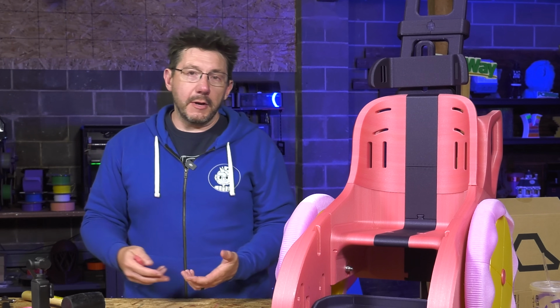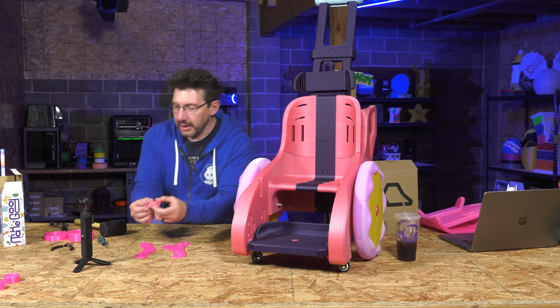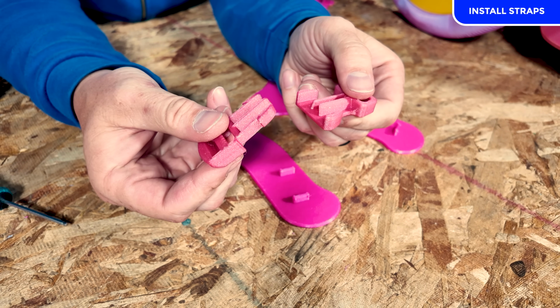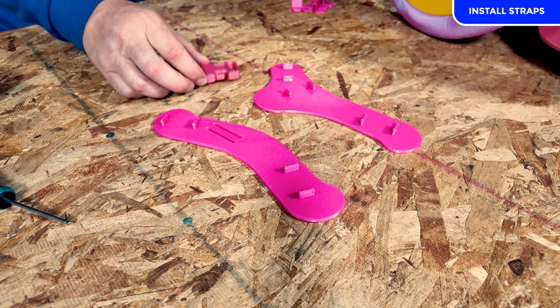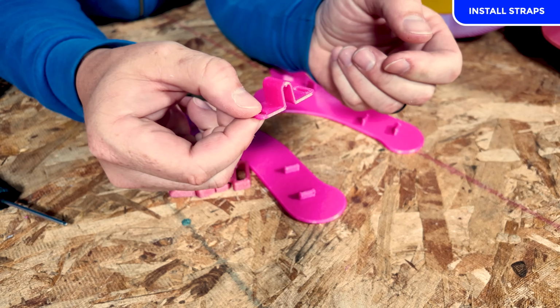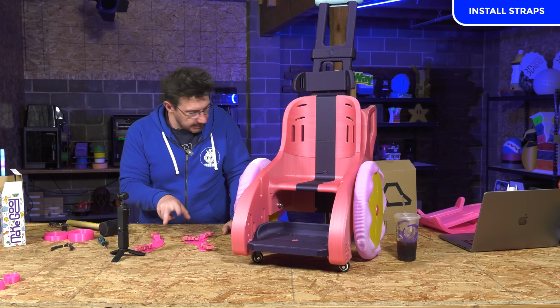Now it's time to talk about the straps and the buckles and the things that kind of keep the kid safe. They're all 3D printed, of course. Check out, look at this buckle. Totally just 3D printed. Again, this is Protopasta HTPLA. And it goes on these. These pieces are kind of what goes on the chest of the kid. And these are held in place by these TPU little snaps. And then you push it and they snap into place.